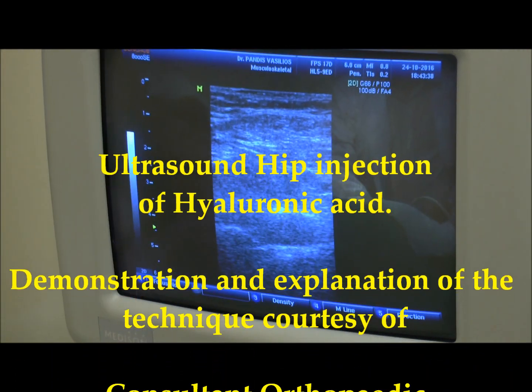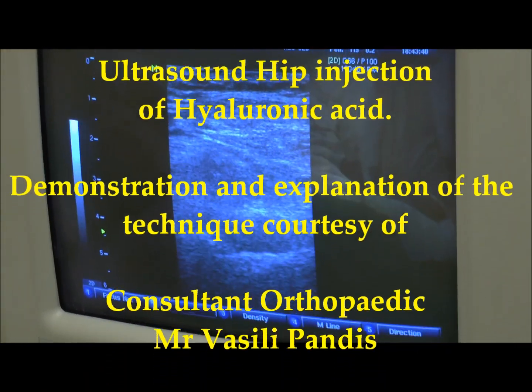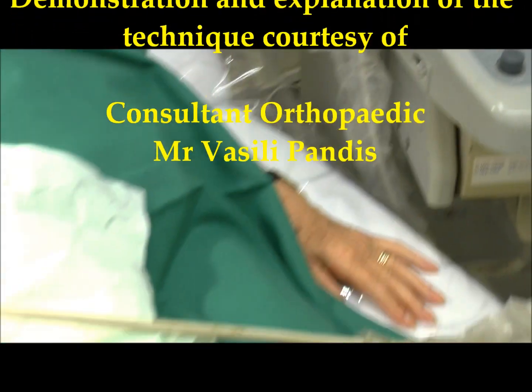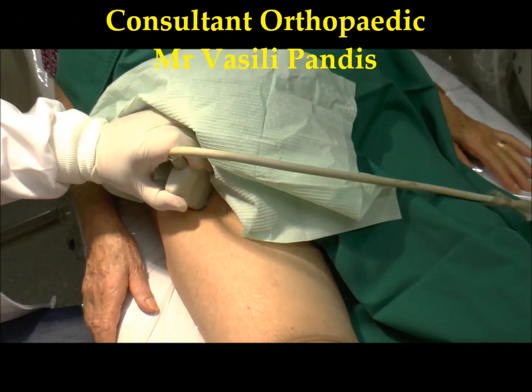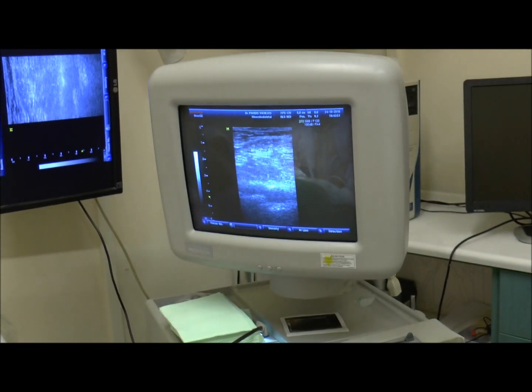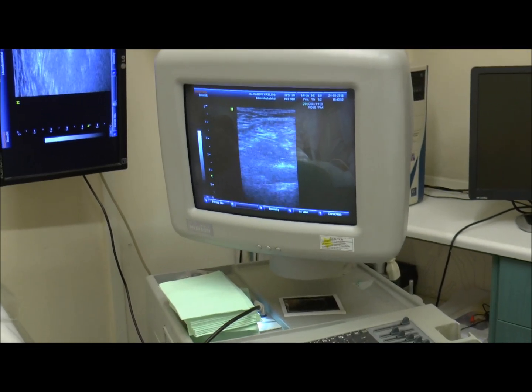This is a visualization of the right hip joint, which we do with ultrasound. It has to go quite deep, and the first thing we want to establish is the femoral neck and the head, and we usually go parallel to the femoral neck.